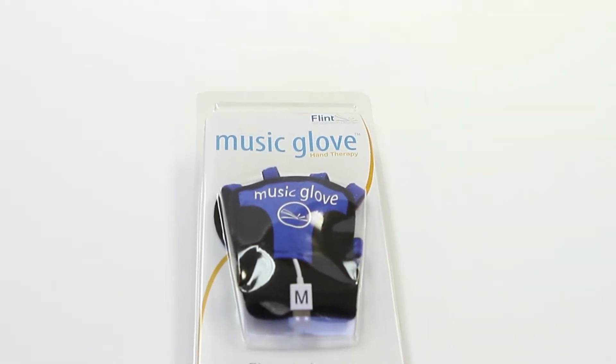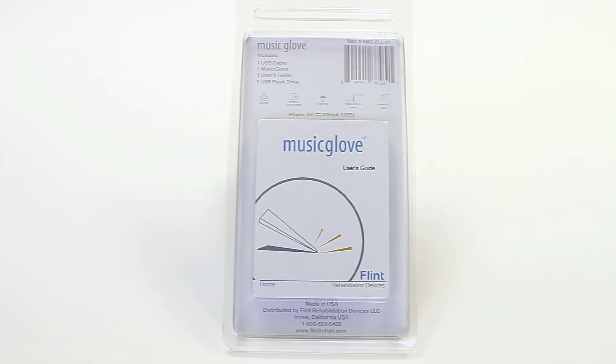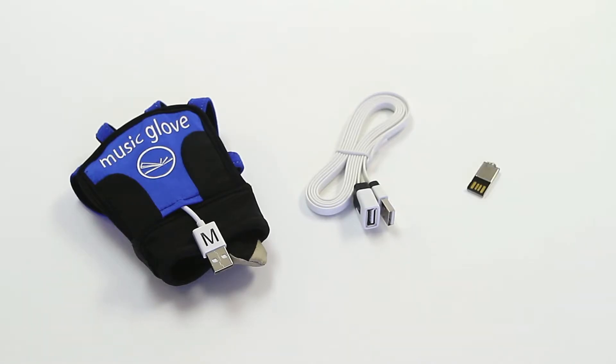To get started, open the MusicGlove box and remove all the contents. Here you will find the user's manual, MusicGlove, and USB flash drive.